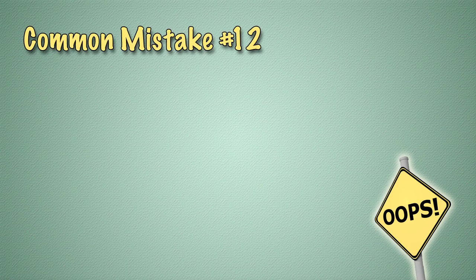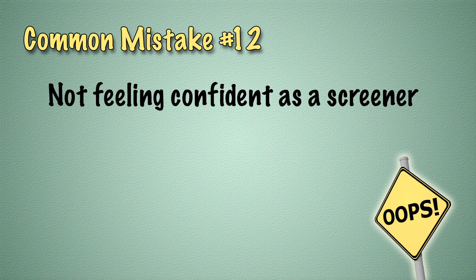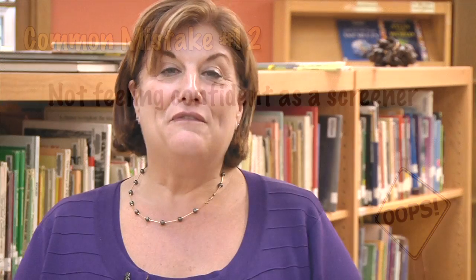Common mistake number 12, not feeling confident as a screener. It's perfectly natural to feel unsure about your skills when you're doing your hearing screenings for the first time. The best advice I can give you is to watch the video. Watch the video carefully and practice the skills that you saw in the video on an adult. An adult is much easier to test, and then you can try the testing again on a teenager, and then once you test a teenager, try a young child. You'll feel much more confident with your testing skills.